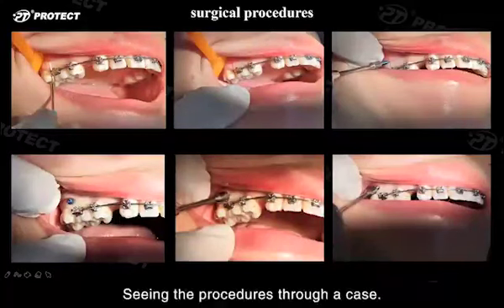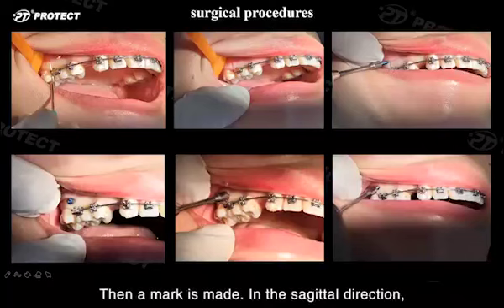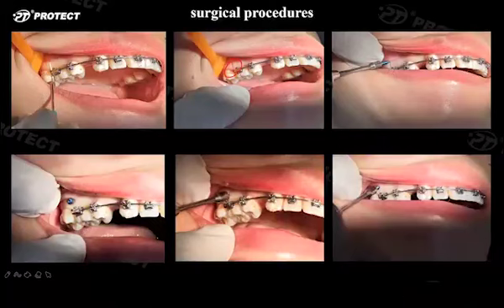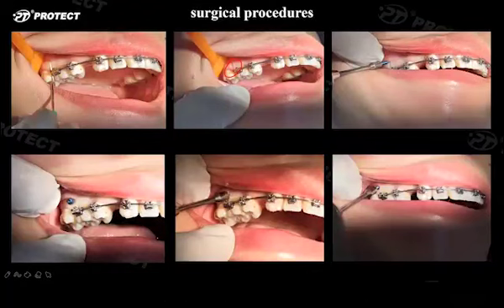Let's see the procedure through a case. Firstly, determine the insertion site by placing the probe. In the sagittal direction, it is on the midpoint of the first and second molar. In the vertical direction, it is on the mucogingival junction, about 5 to 6 mm from the cervical margin.